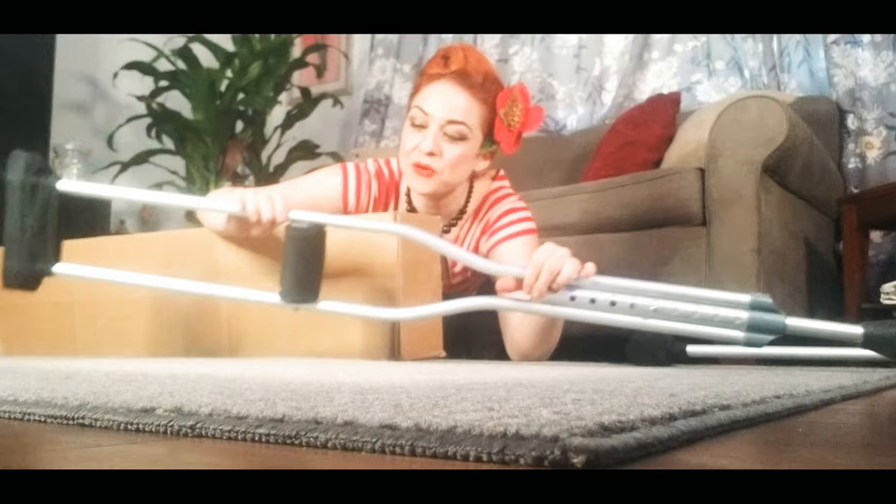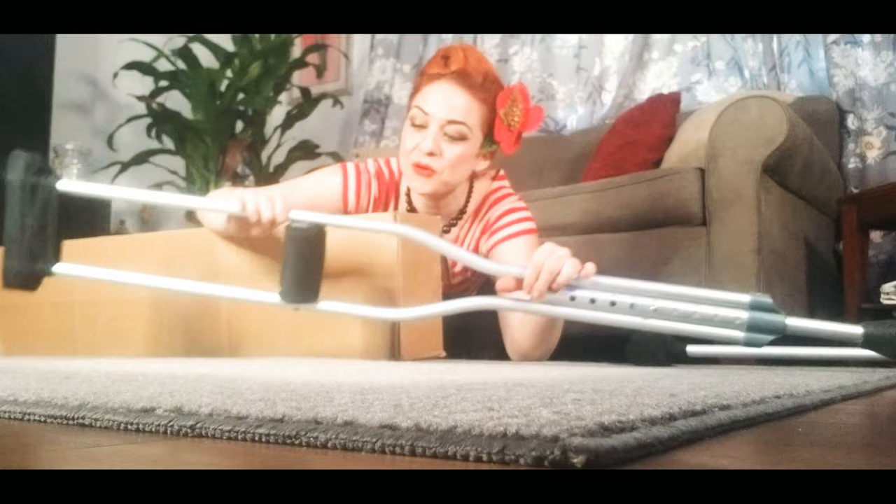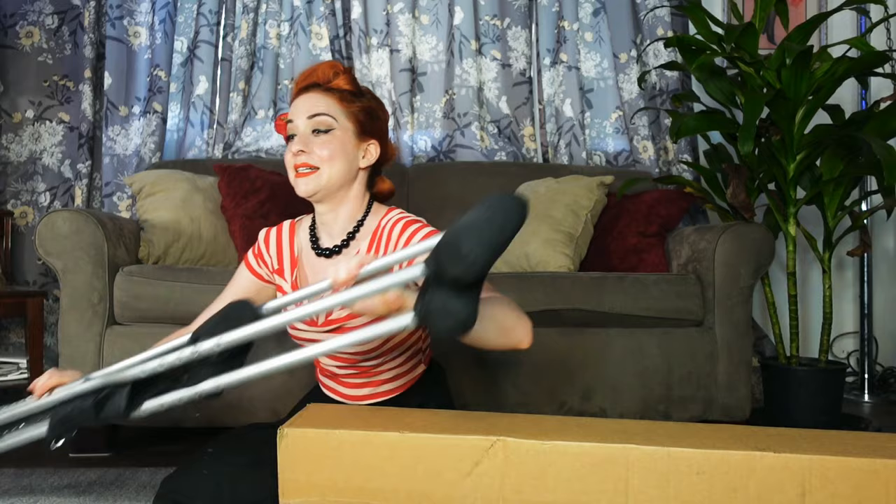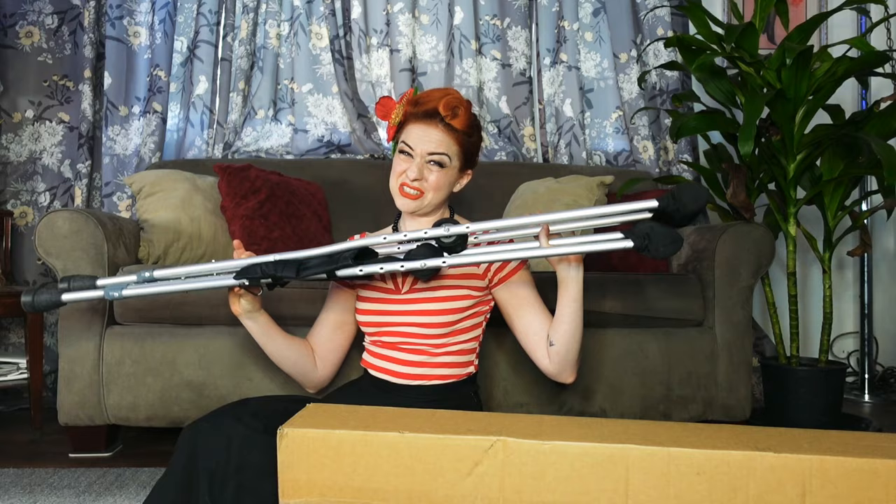So for today's video I'm going to be doing an unboxing. These guys right here — they're great, but this butterfly clip is just kaput. It's sharp, it's just no good. And in my opinion these are not the best looking color — I enjoy silver but I just don't really like this silver on my crutches, so I decided to get a new pair.